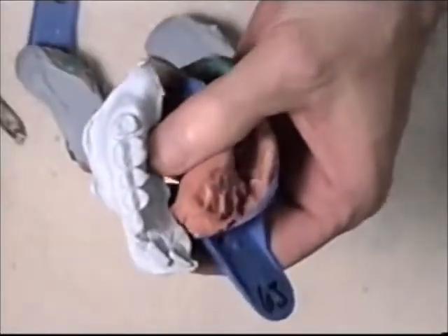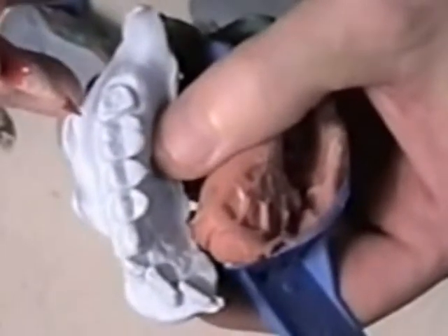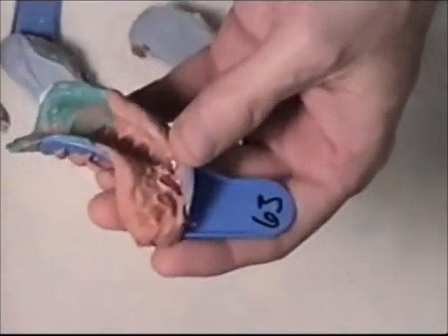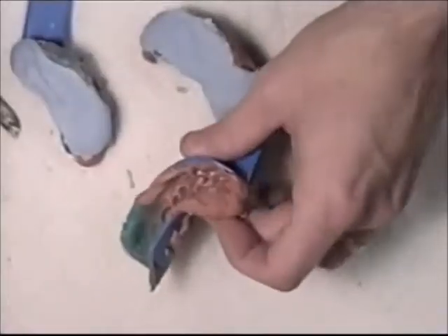Now take a look at it. Make sure there are no bubbles, especially around your prepped area. If there are bubbles, then you are probably going to have to re-pour the model.